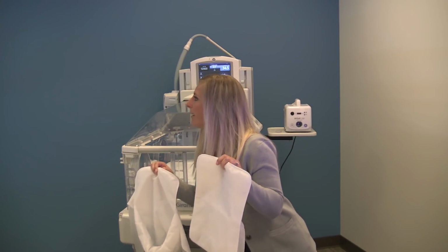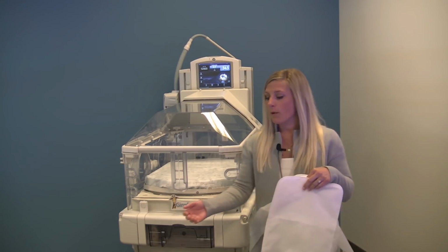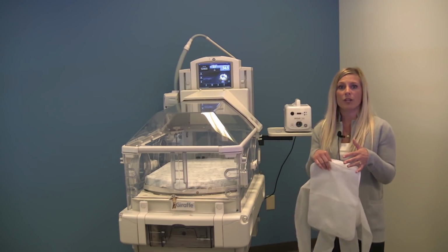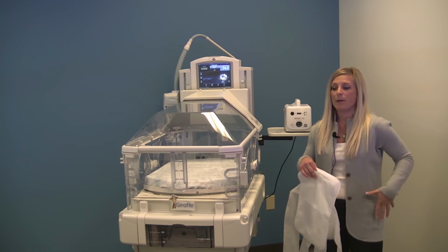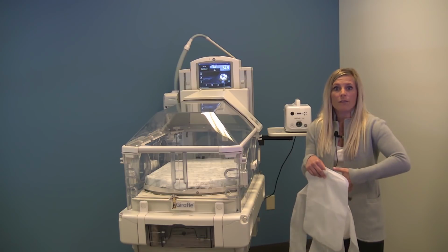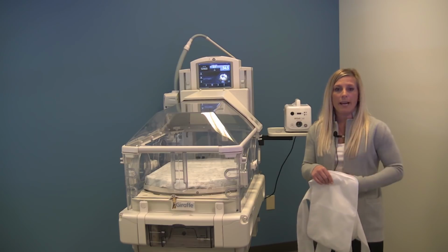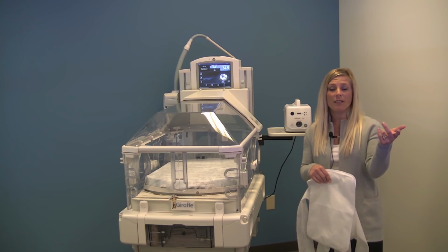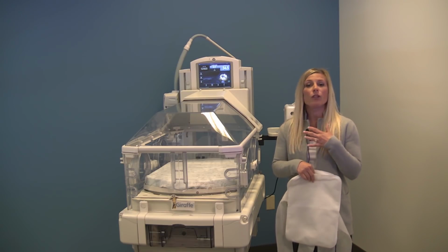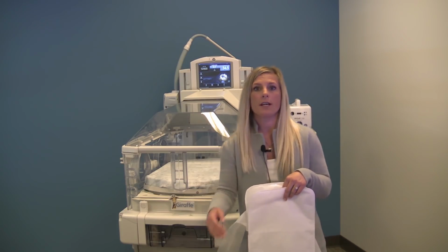So for instance, it looks like we've got a question. Is there a weight limit for the pad? Oh, excellent question, Marianne. So there isn't. Where we kind of go in what Tracy was saying with the surface area is that you want to make sure that there's coverage. So for those larger babies, the nice thing about that size pad is that regardless of weight, it's more about the surface area coverage. So just really wrapping them up and getting that flank coverage, possibly adding in a second blanket. That was actually a question in our last session, and we'll review that towards the end. We just kind of added it in for you. But at any rate, there's no weight limit for the pads themselves, more just a guidance of what you want your surface area coverage to be.